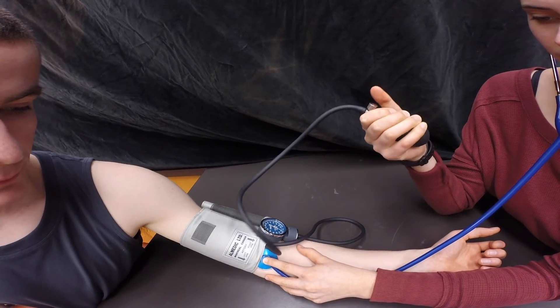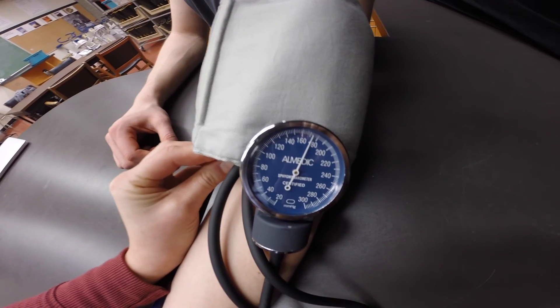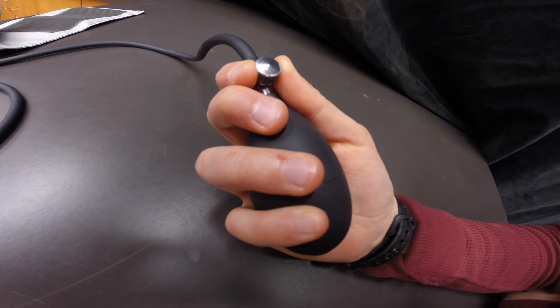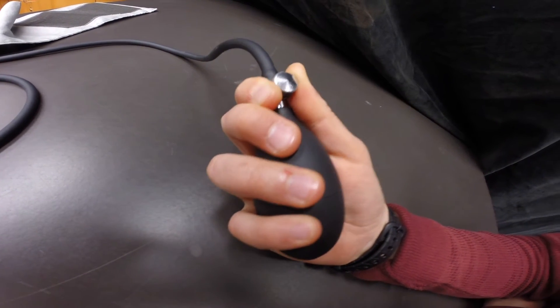Now rapidly inflate the cuff to 40 mmHg above where the beating stops, about 180 mmHg. Open the valve slowly and release the cuff pressure at a rate of about 2 mmHg per second.